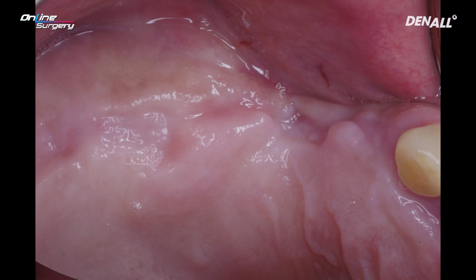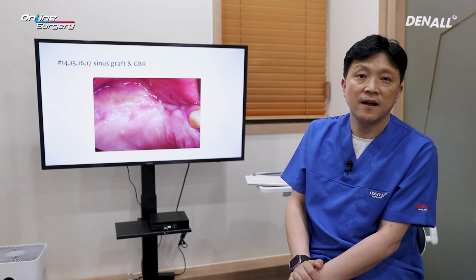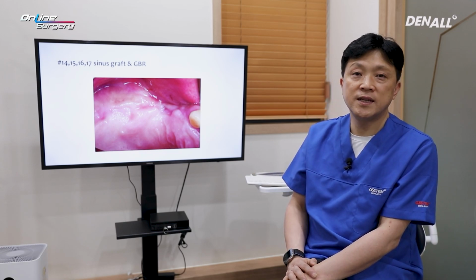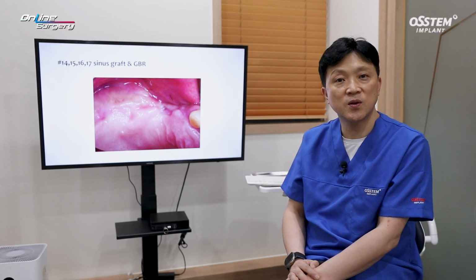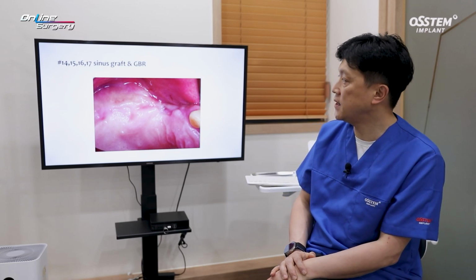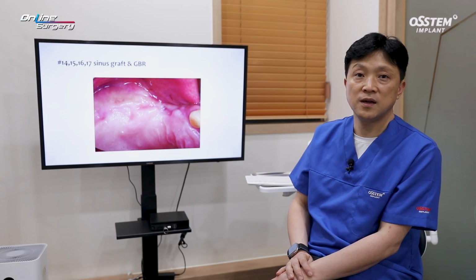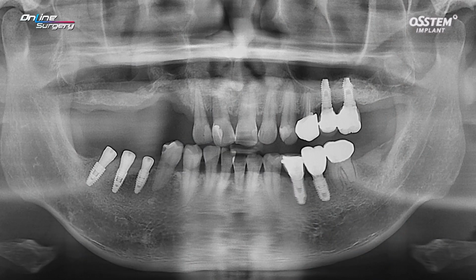If you look at the intraoral photo, there's significant buccal depression in numbers 14 and 15. The patient has a history. GBR was done previously, but the bone regeneration in numbers 14 and 15 was not good. Fibrous healing occurred and there were problems. The plan was to do sinus graft again along with the GBR to restore bone quantity.